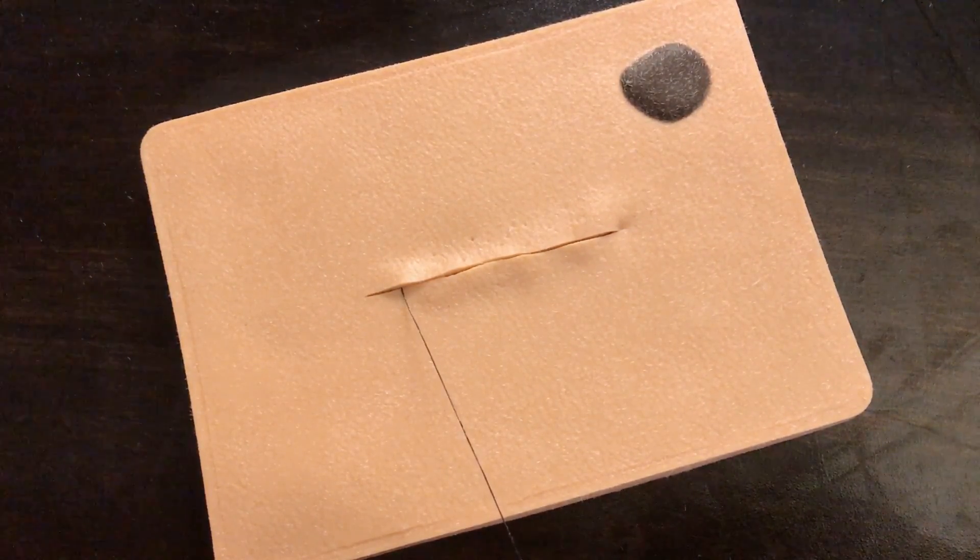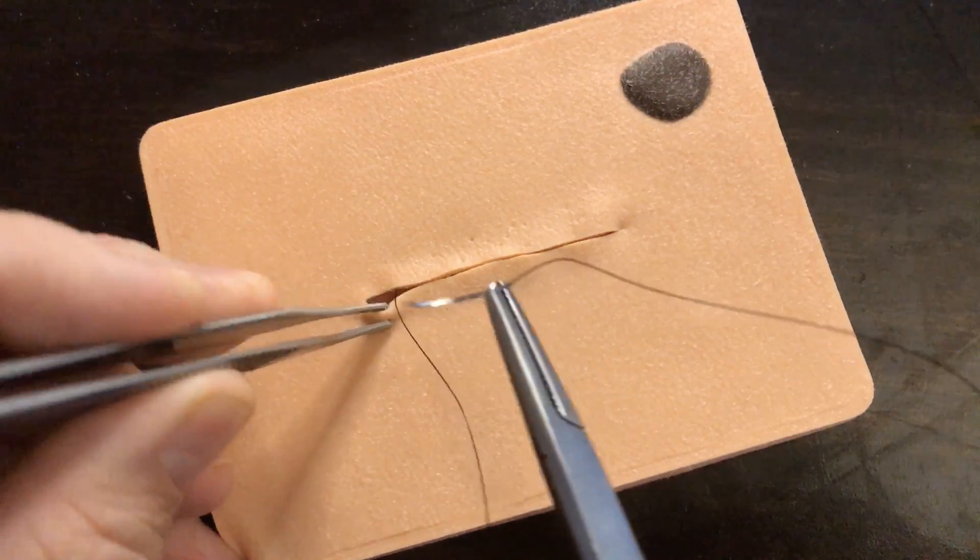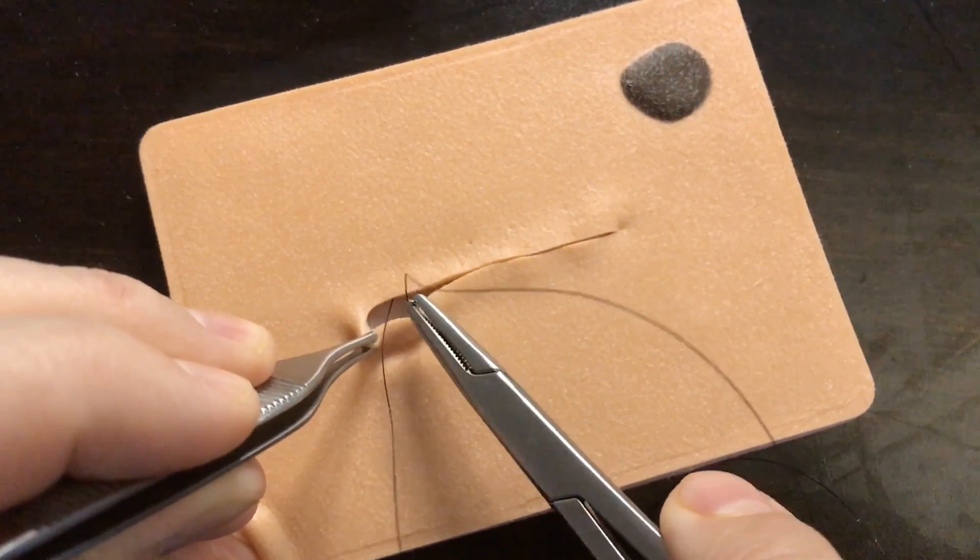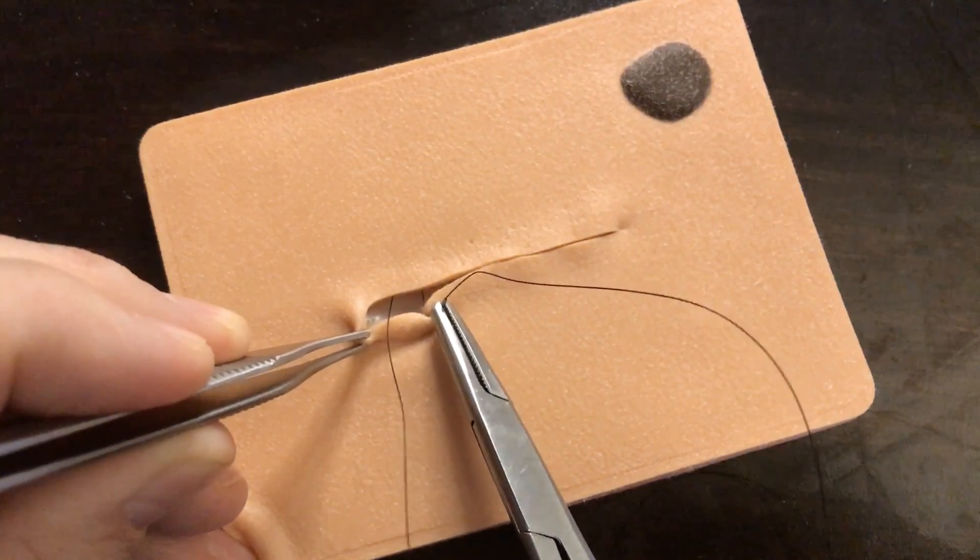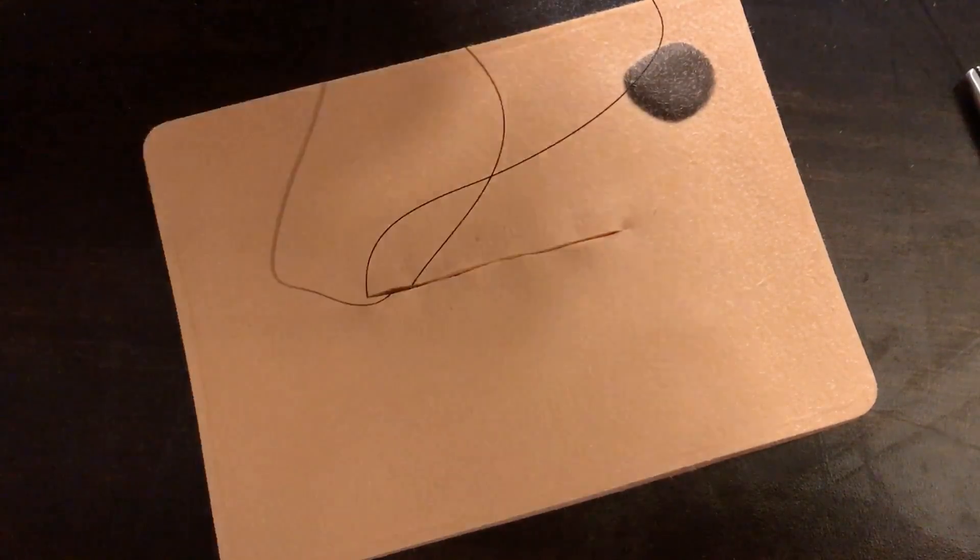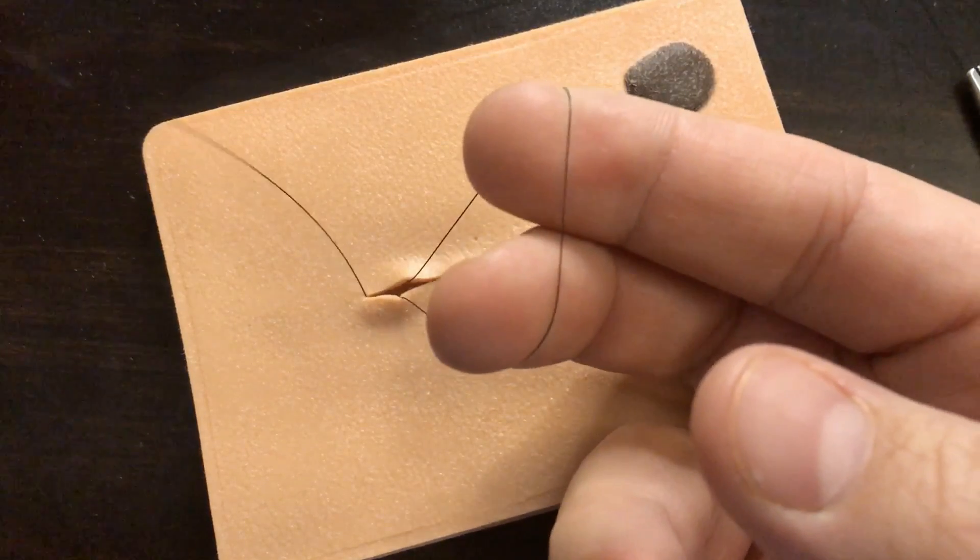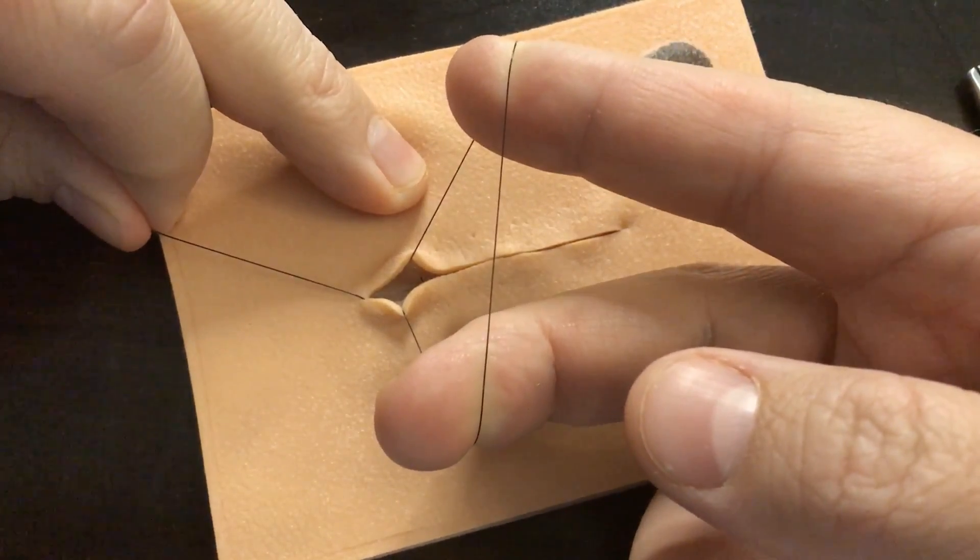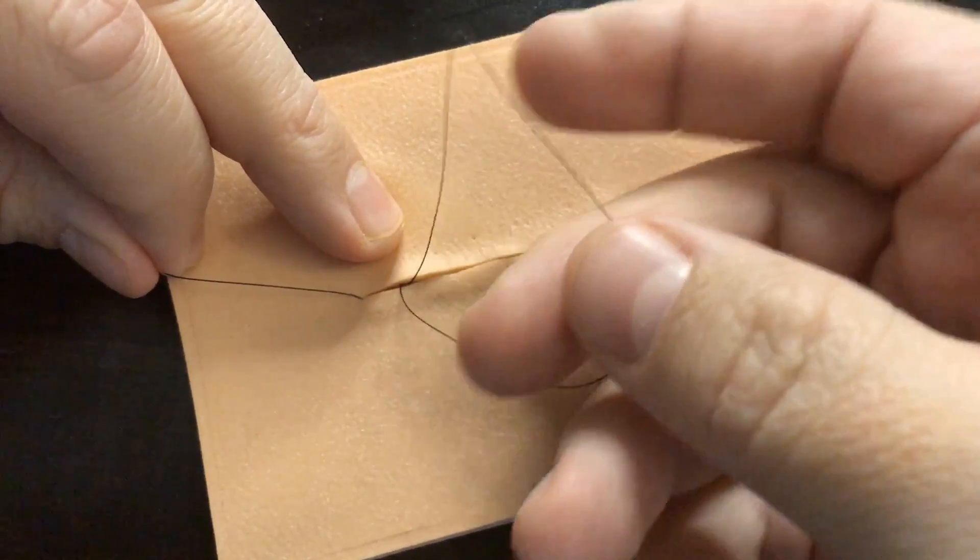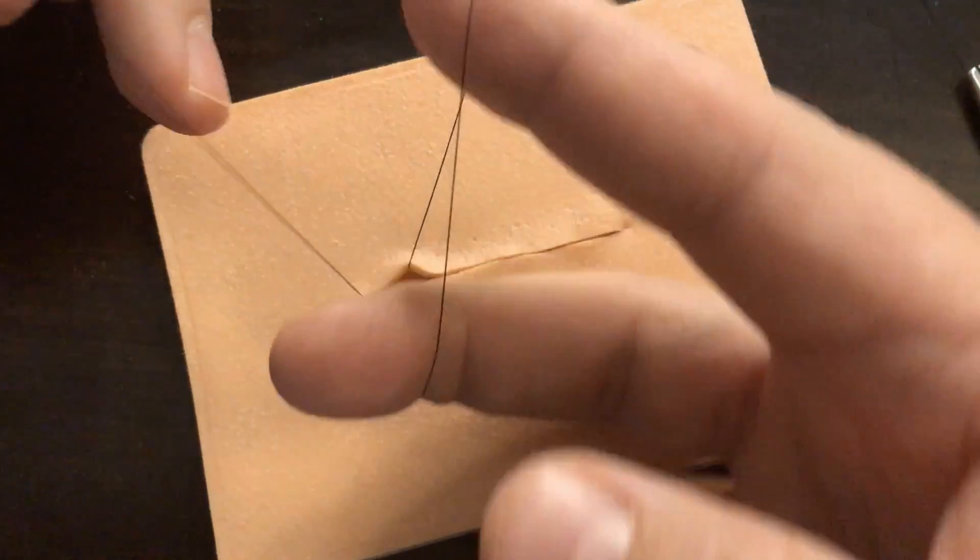So here we're getting to the end. So I want to show you the Aberdeen knot. So I want to be a little closer to the apex with this, and so I'm going to do one more pass and I'm not going to pull it all the way through. So you'll see what I mean. I'm going to do my subcuticular suture here, making sure to stay in that same horizontal plane and really superficial. Now, here's the Aberdeen knot. Rather than pulling this all the way through, I'm going to use this loop. Now with this loop, I want to make sure, first of all, that my loop isn't crossing. What I mean by that is this. If it was crossing, I can't open up that incision. So I want to make sure that I've got it opened up this way so that I've got the loop freely able to move.